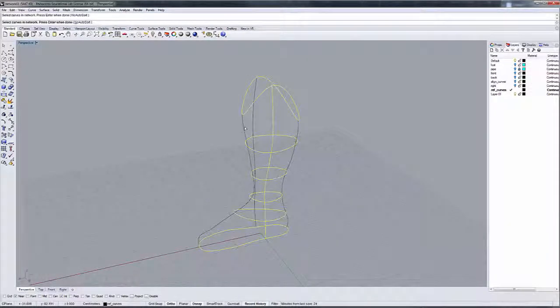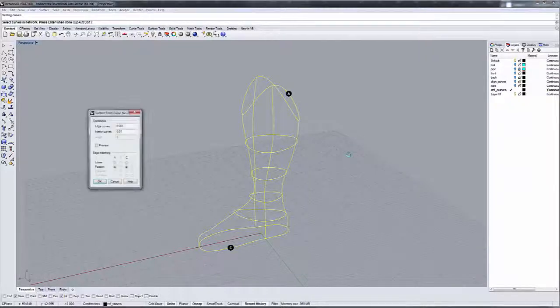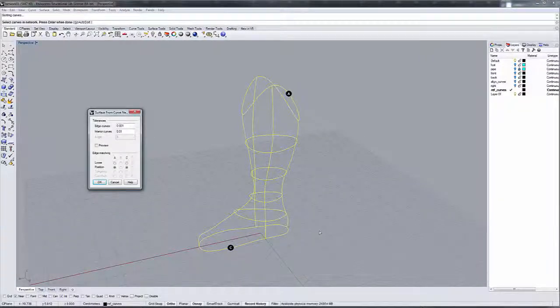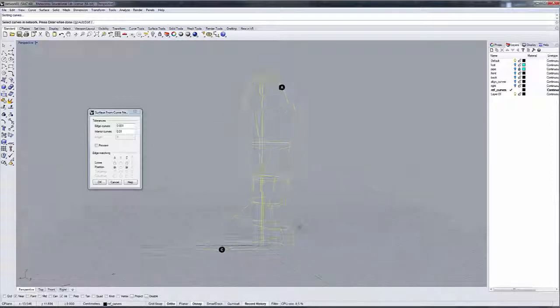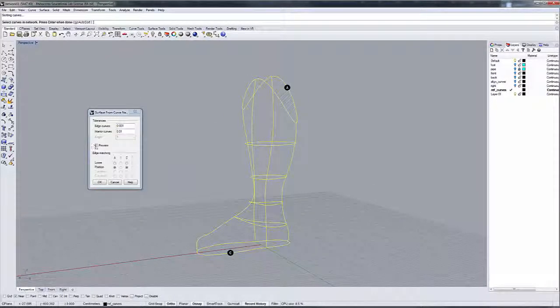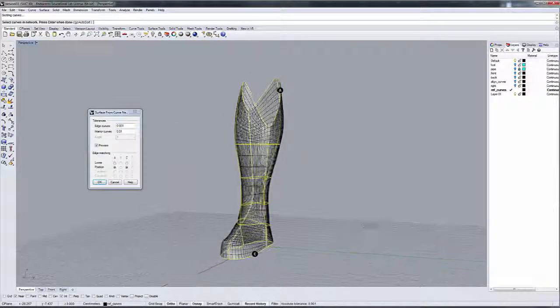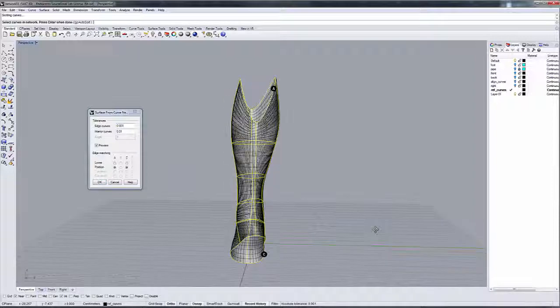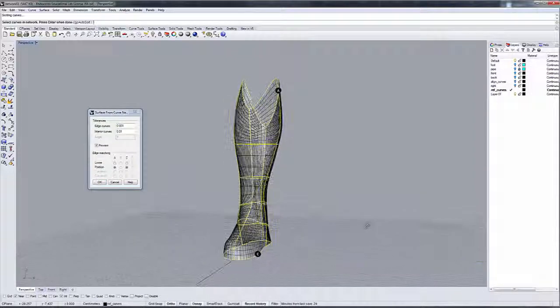And I'm going to select the curves in the network manually and see if this helps. Like that. And then I'm going to select these. It might ask me to redo this again, but as I did there, I sorted them manually, and it shows me my curves.